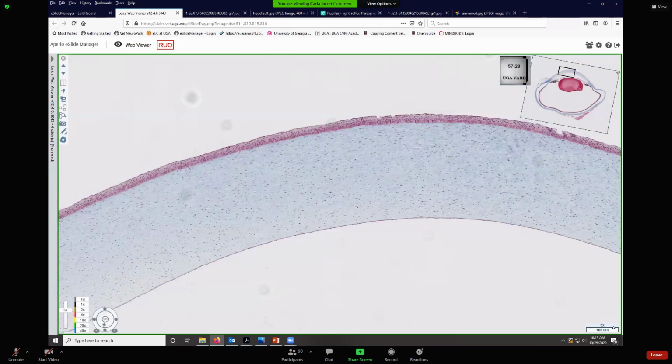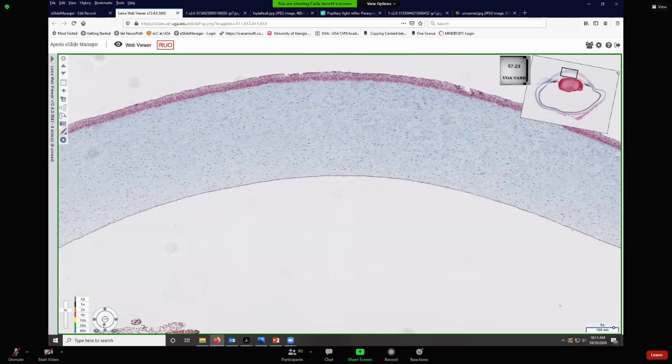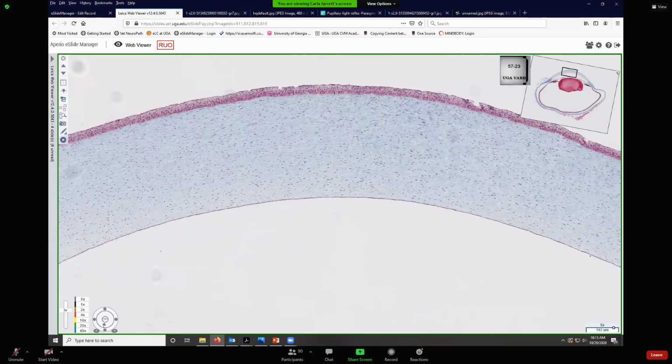all these layers. All right, so way to survive 3 hours. Those layers are pretty easy. They classically show up on the exam questions. And clinically, boy, those layers are really important to you, especially the endothelium back here. If this endothelium doesn't remain intact, then the cornea will get opaque. But you'll learn all about that in your ophthalmology course.